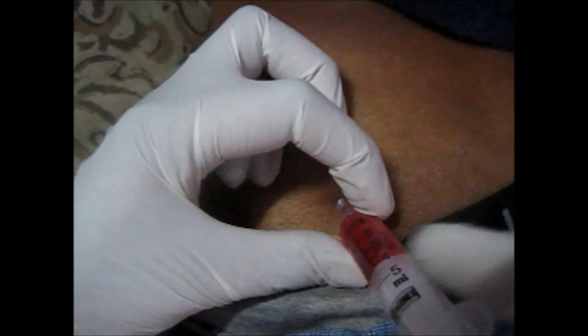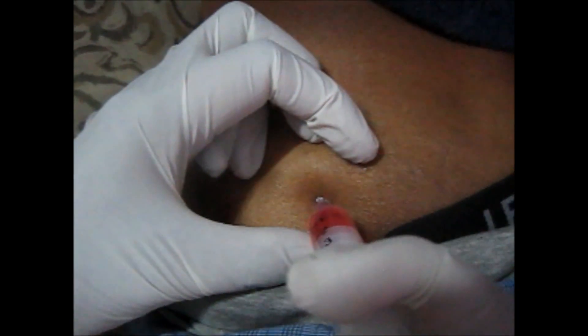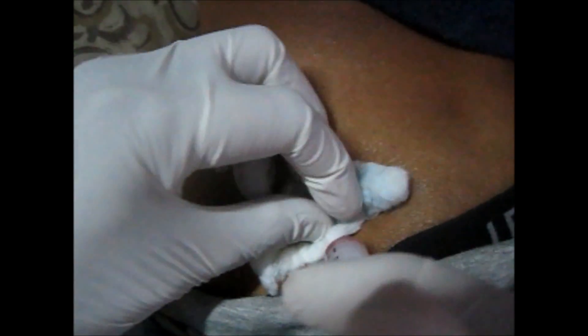Stretching will cause less pain to the patient. After that, retract the injection syringe to check whether you have not punctured any artery or vein.